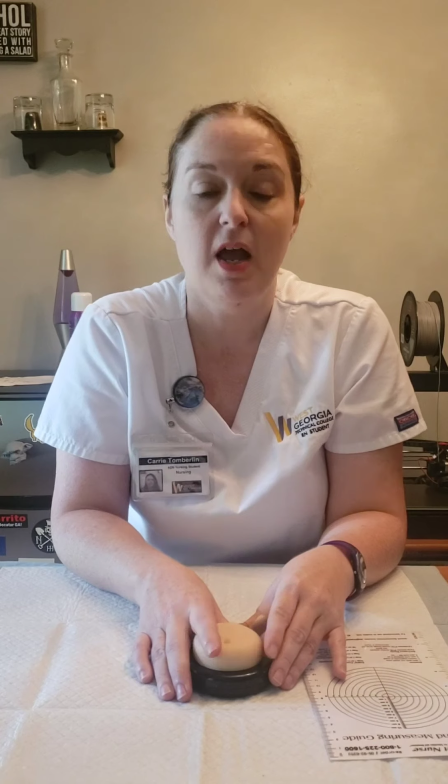Since my patient had a reading of 5 millimeters and they are an IV drug user, that would mean that they have a negative result and they would not need to have follow-up at this time. If their result had been 10 millimeters or greater, it would have been positive.